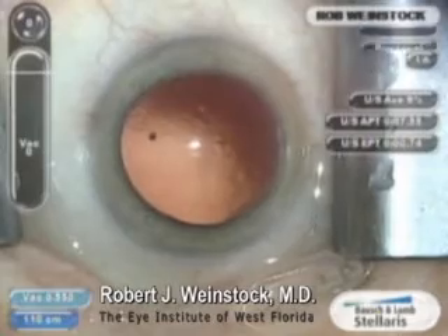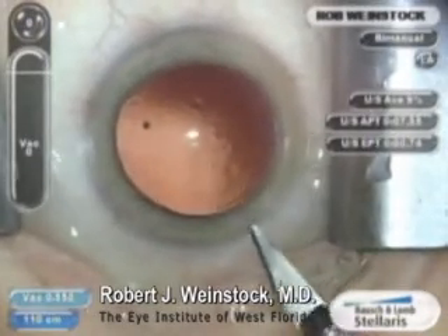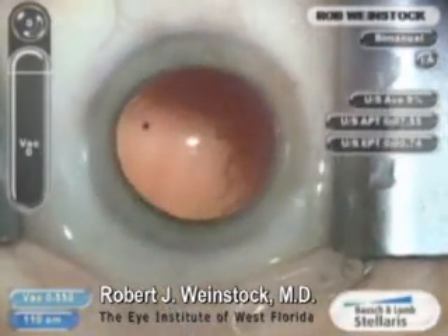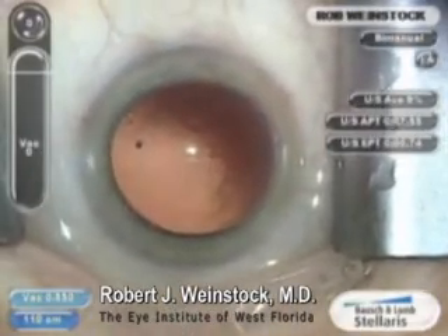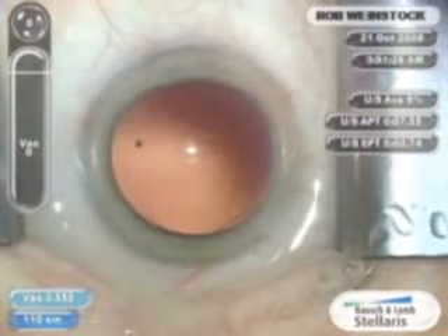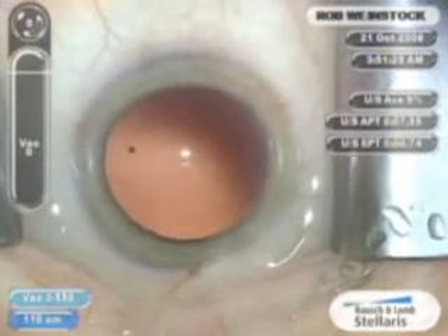After a complete cataract removal, cortical cleanup and enlargement of the wound to 2.8 millimeters, the CrystalCert injector with the CrystalLens already loaded inside is placed through the wound to a position central in the eye and deep to the plane of the capsulorexis.